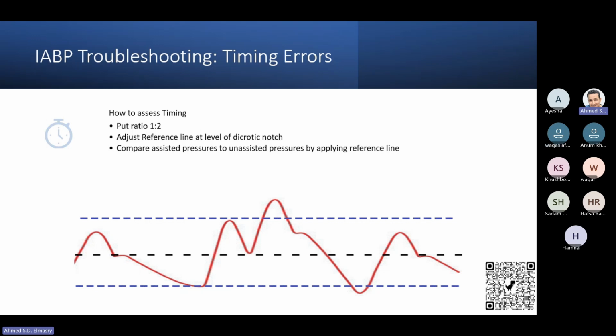The most reliable option is to move to the pressure trigger, and then reduce the augmentation to 50%. I don't know exactly why they want to decrease the augmentation to 50, but I read this in many articles.